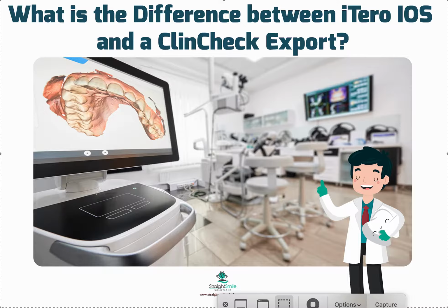Doctors get confused, but most commonly patients get confused as to what they're looking at and what it means. So if you go into your doctor's office and you're getting psyched up for Invisalign and you get scanned, and the machine will look something like this thing right here. If instantaneously you see your teeth on the computer screen and a little setup as to what your smile might look like, that is an iOS, or Invisalign Outcome Simulator. It's just the AI that's built into the software, and it's kind of just showing you how your teeth might look nicer according to the computer.